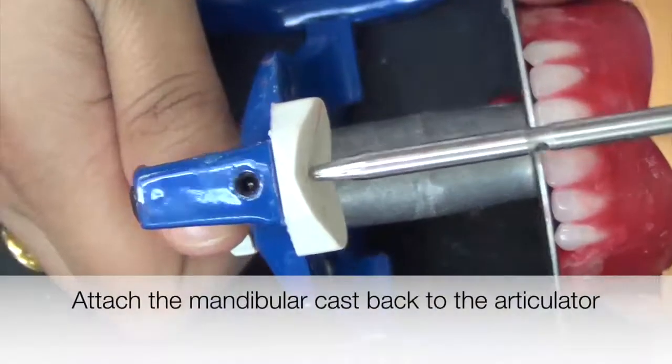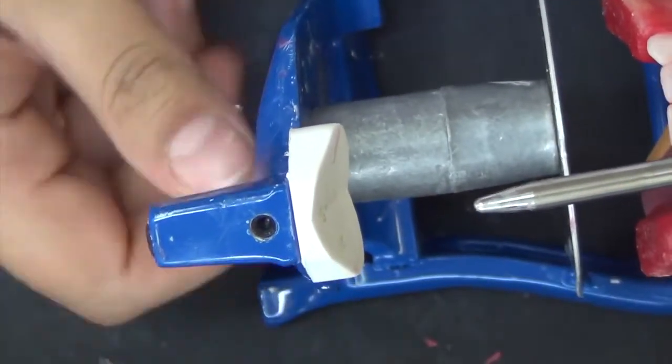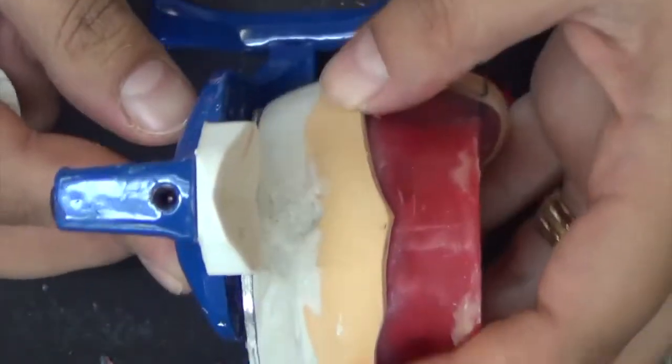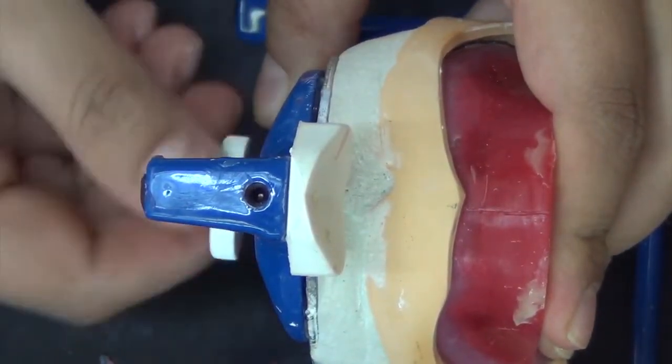Arranging the mandibular anterior teeth. When arranging mandibular anterior teeth, you need to create a minimum overjet and overbite for the standard anterior tooth setup. Use the maxillary wax rim as a guide to position the mandibular teeth.